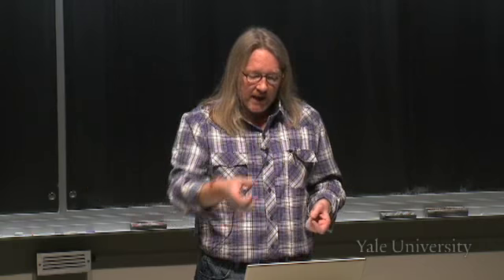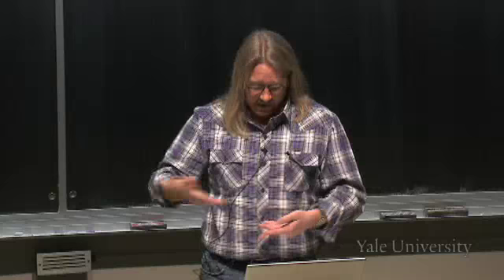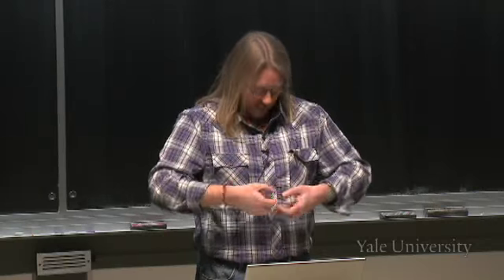Okay? Now, because it's a narrow beam, you're doing this in a line instead of a plane, and you're spinning it around. You're really doing a slice through the body with each rotation of the device, right? If I spin this all around my body, then I'm basically moving this line around different angles, and I'm looking at one slice, maybe between here and here, all the way around. And so you can reconstruct an image of a slice that might look like this.